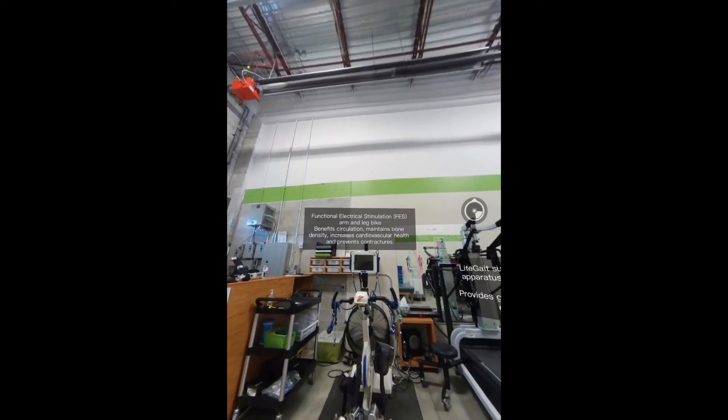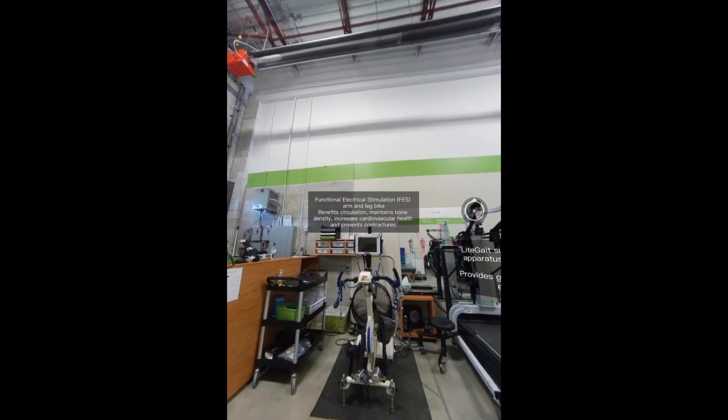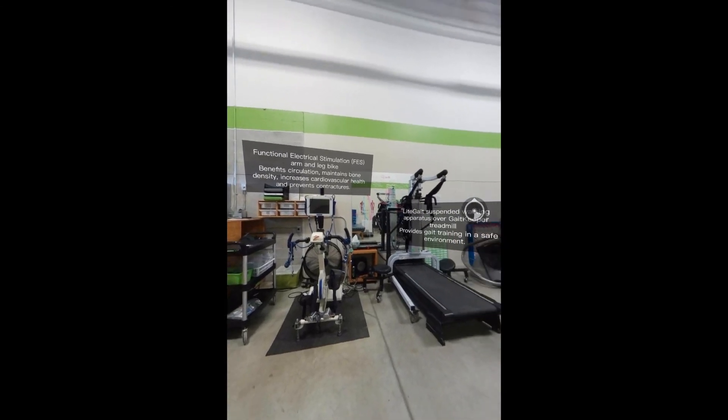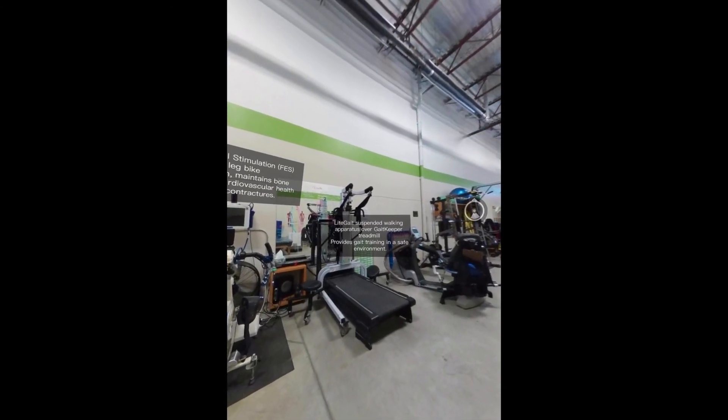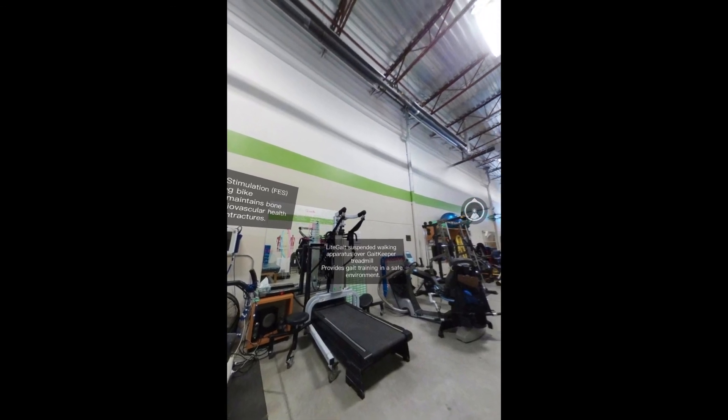The FES Arm and Leg Bike benefits circulation, maintains bone density, increases cardiovascular health, and prevents contractures. The Lightgate and Gatekeeper Treadmill provides a safe environment for the client to practice walking movement patterns.